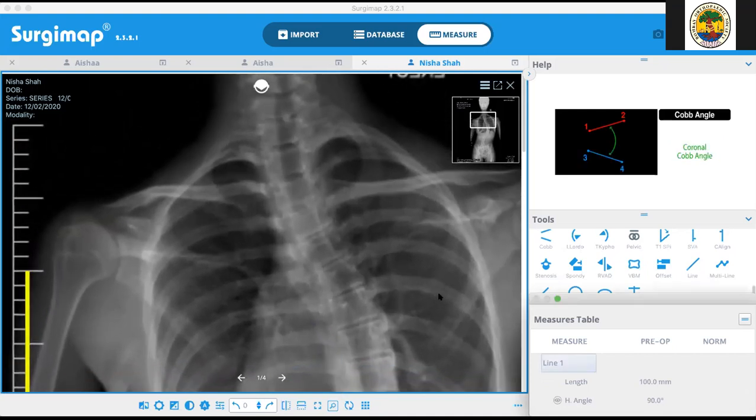One thing I have found is that if you have a long measurement tool like that, don't measure short. If you go from one end to the other and say 5 centimeters, you are reducing the error. Instead of a lesser amount, not 5 centimeters, let's say 20 centimeters on that legend. So choose from one end to 20 centimeters, and you are reducing error compared with choosing from one long line to the other long line, which will be 5 centimeters. It's just reducing error, that's all. But I don't think it makes that much of a difference.